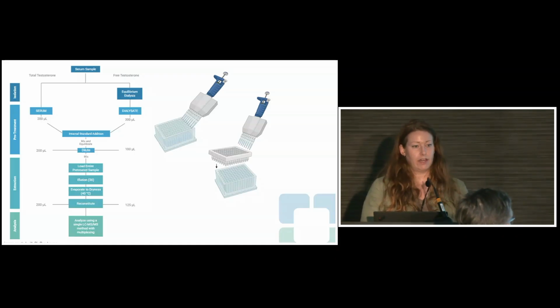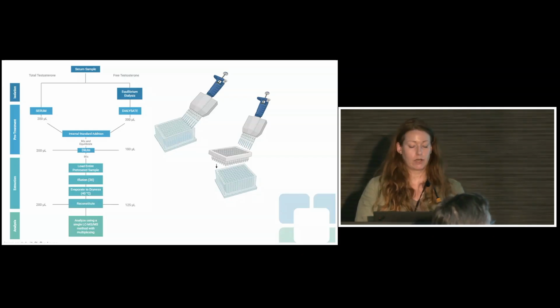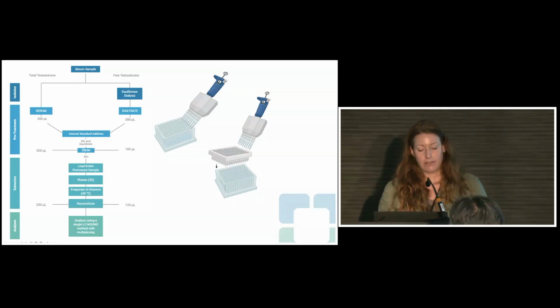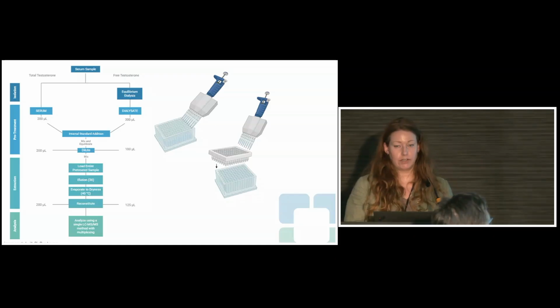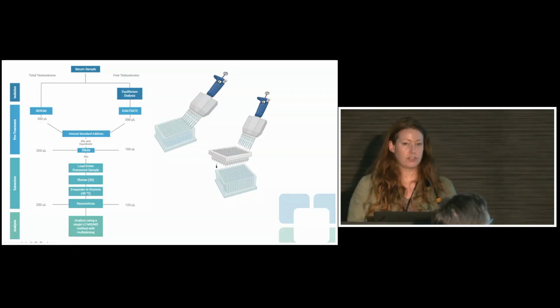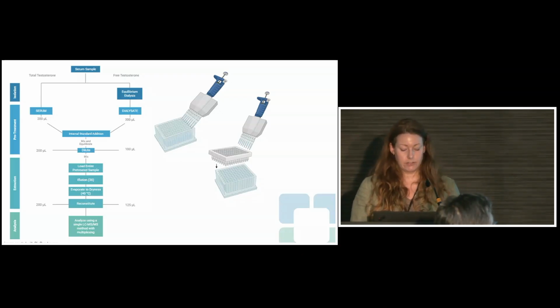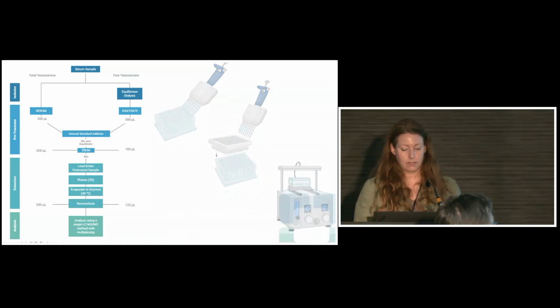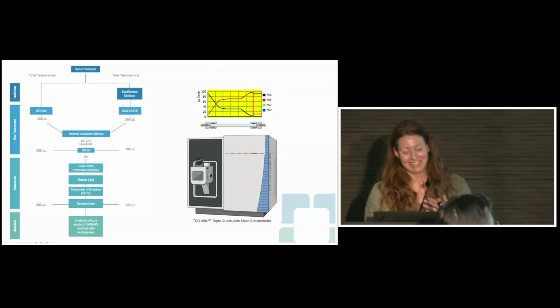They're equilibrated there for 5 minutes just to let everything sort of glom on, and then we use the same exact procedure for total and free, where we'll extract with 3 elutions of hexane and ethyl acetate. After that, the plates get dried down at 40 degrees C, and then we're reconstituting in the same solution, just different volumes. We're reducing the volume for free testo because we want to get that signal boost, and then they are analyzed ultimately on a triple quad Thermo Altis Scarlet, who's very dear to my heart.